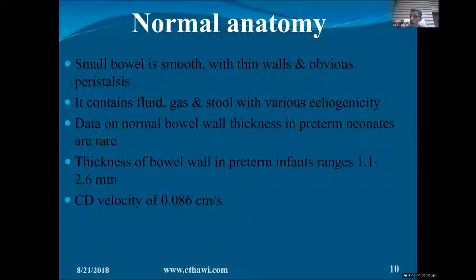So if you put your gate at 0.5, you will listen to all of them. But if you put your gate at 0.3, then you will listen only to C. You get it? You're ignoring 0.1 and 0.2 and 0.5. That's pulse Doppler. That's the difference. In pulse Doppler, you concentrate on one area and ignore the rest.